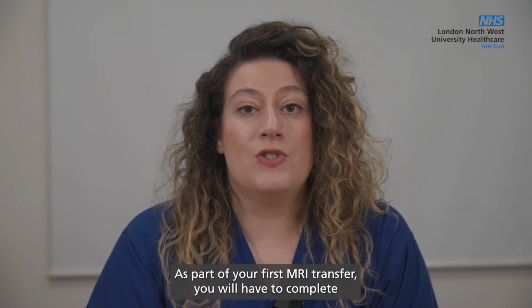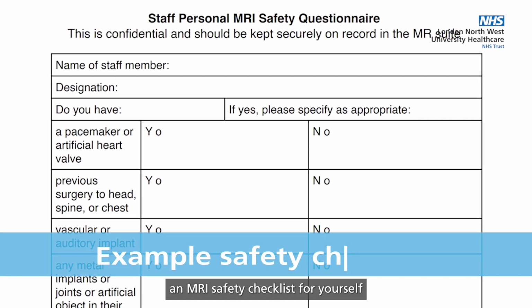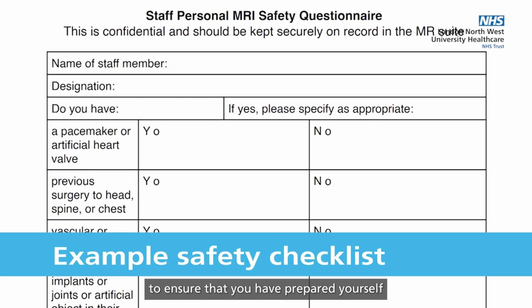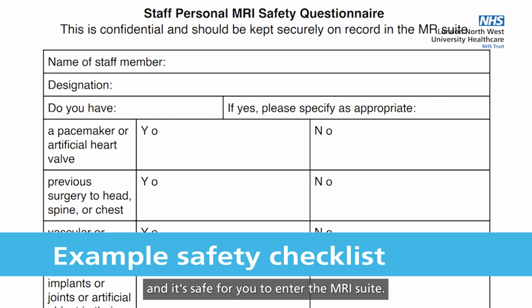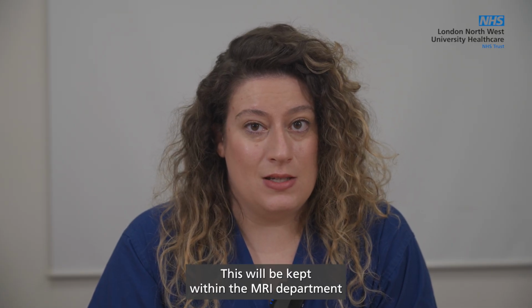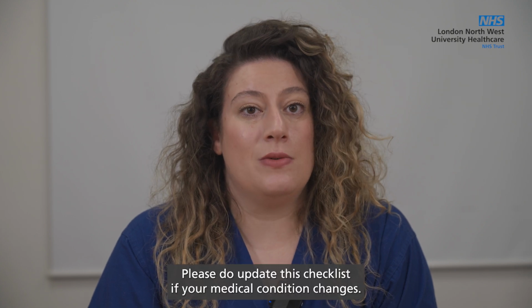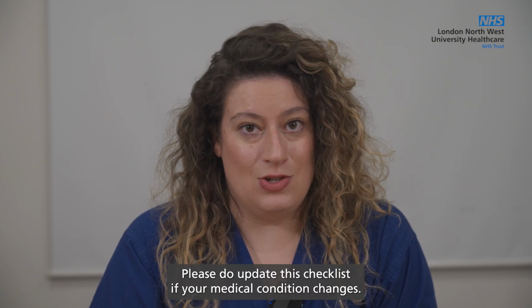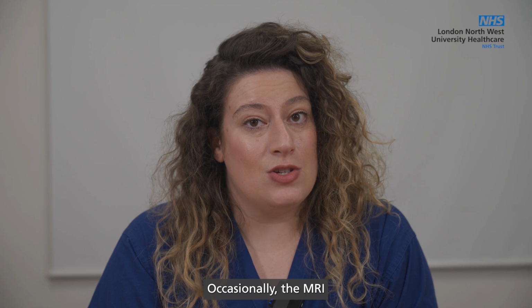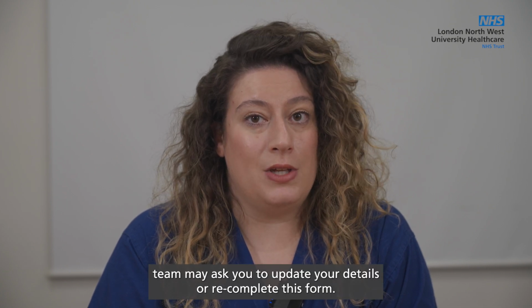As part of your first MRI transfer, you will have to complete an MRI safety checklist for yourself to ensure that you have prepared yourself and it's safe for you to enter the MRI suite. This will be kept within the MRI department and you will be marked compliant by the team. Please do update this checklist if your medical condition changes. Occasionally, the MRI team may ask you to update your details or recomplete this form.